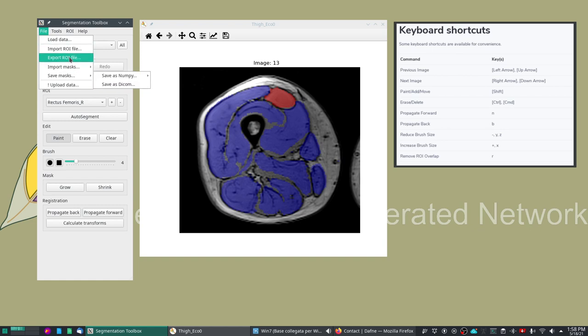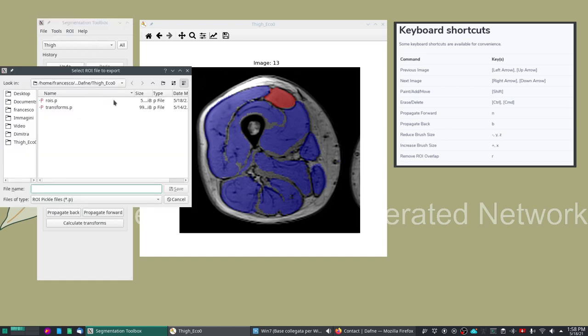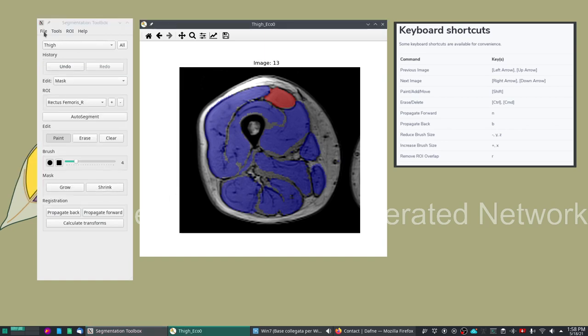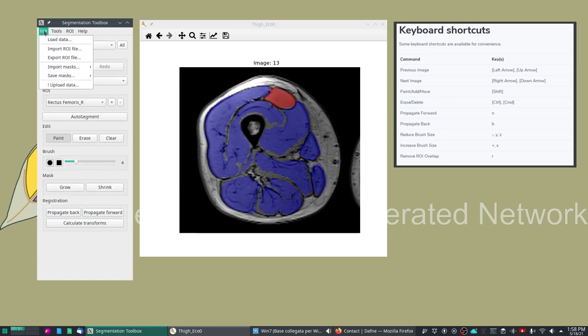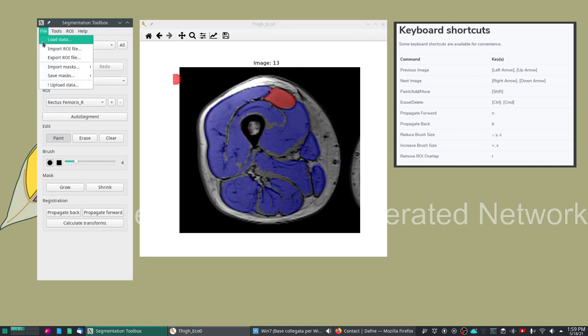Importing and exporting of ROI files is done and you can save the ROIs in an internal format, it's a Python pickle format. You save it as my ROIs and then you can load them again. But these of course will only work on the same dataset, so it's used to store your intermediate work. But if you want to apply the masks on a different contrast then you will need to save the masks as DICOM.